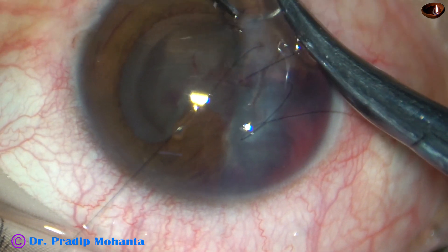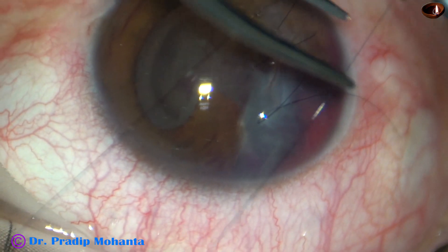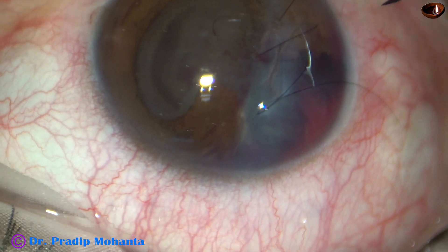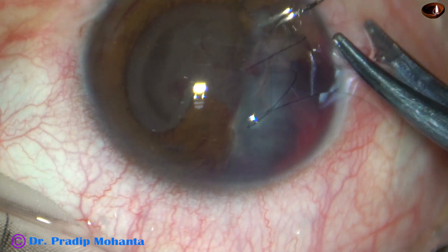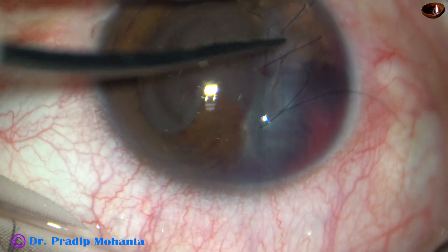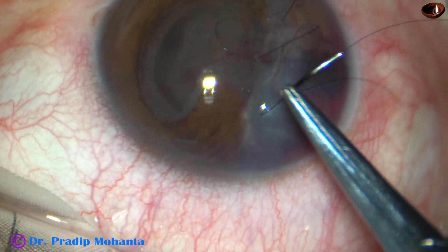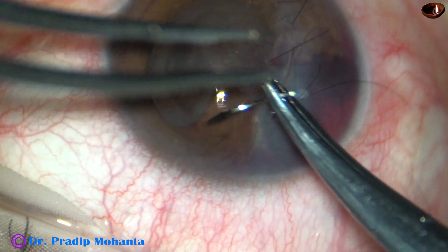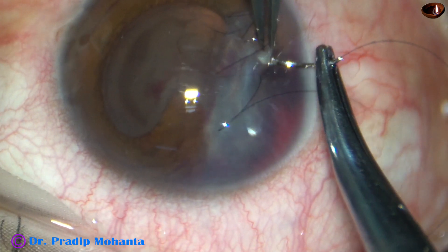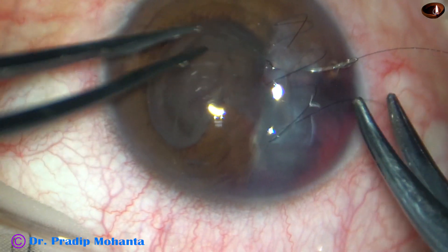So bites are being taken. This is the fourth bite. And now I am going to come back. In my left hand is a tooth forceps and in my right hand is a needle holder that holds the needle of the 10-O nylon. Now, in between two bites, I am placing one more bite and coming back to the first bite. And this is the continuous shoelace suture.